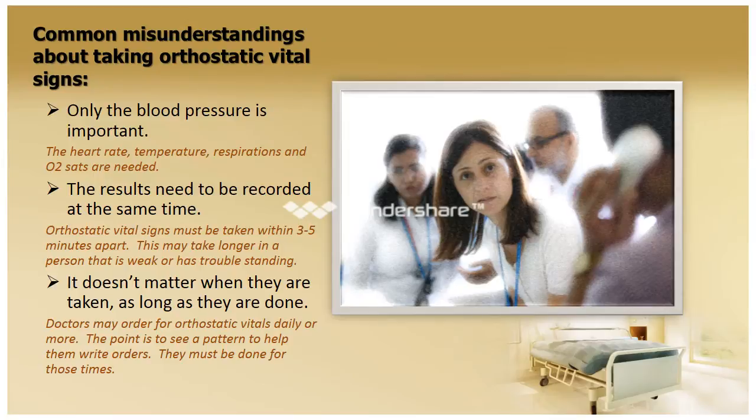The physicians and other providers order these tests for a reason. The orthostatic vital signs are a form of diagnostic test, and it allows them to visualize a pattern. They may order them twice a day, 3 times a day, every 6 hours, however they order them. It's important that we have them recorded appropriately so that when they log onto the EMR, they can see how the patient is changing. Did they have this drop in blood pressure before they took their pain medicine, or was this after? Was this after we had done a treatment, or before any IV fluids were administered? This is very important.